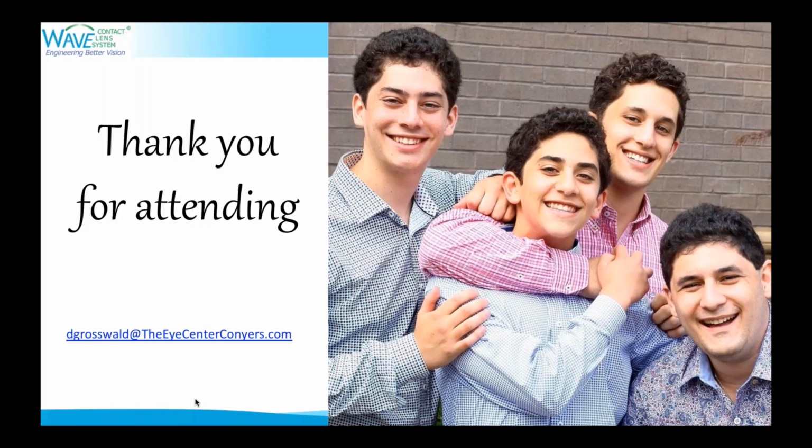Okay. And I guess kind of relating to the question we just had, how do you fix lens rotational issues? Well, with the prism ballast, it's tough. I mean, again, it didn't happen a great deal, but when it happens, it's really frustrating, and you're chasing your tail with a front surface toric lens. But adding the prism ballast and making sure that you're just not too tight in the periphery, and otherwise upgrading your technology. Okay. Thank you.